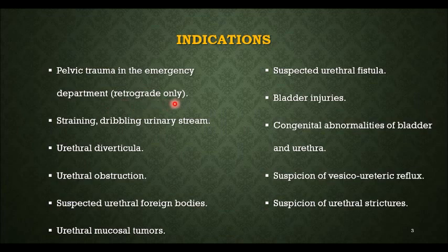In this case, retrograde study can be performed only when there is straining, dribbling urinary stream, when there is suspicion of urethral diverticula, urethral obstruction, suspected urethral foreign bodies, urethral mucosal tumors, suspected urethral fistula, suspected bladder injuries, congenital abnormalities of the bladder and urethra, a suspicion of vesicoureteric reflux, and when also there is a suspicion of urethral strictures, you can recommend a CUG or urethrography.